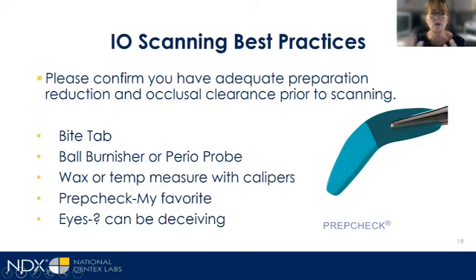So as with most things, from a foundation standpoint, check, right? Just double check that you have enough occlusal reduction before you ever take a digital scan or a physical impression. And so I will ask people about that. And a lot of times people will say, oh, I eyeball it, been doing this a long time, or they haven't, and they still say they eyeball it. Well, I mean, that's good, but think about the distal buccal cusp of number 2. That can be challenging to eyeball it. Can you really see that well?